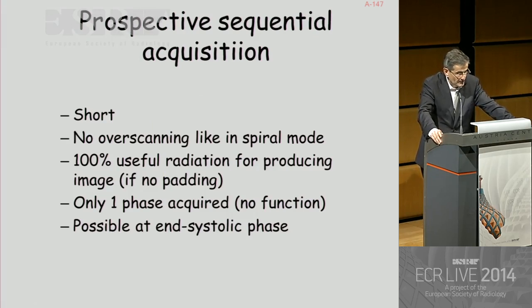The exposure time is short. There is not the problem of overscanning due to the spiral mode, which increases the radiation dose, which exceeds the area to be imaged. And 100% of radiation which is emitted is used for image, if you don't use padding.